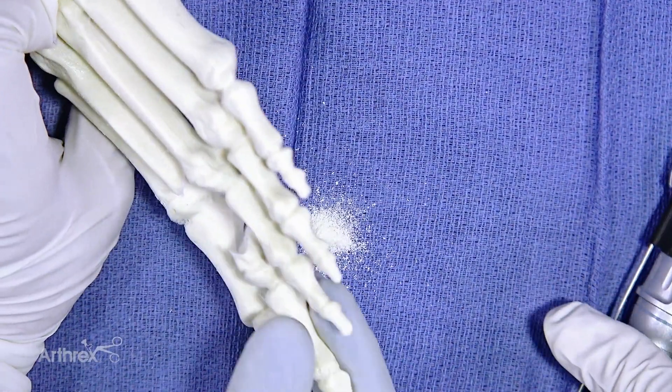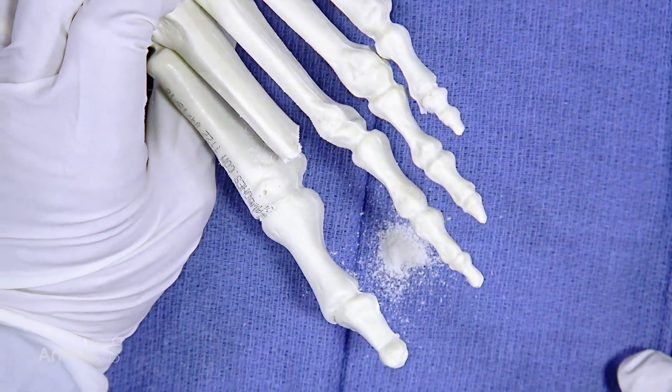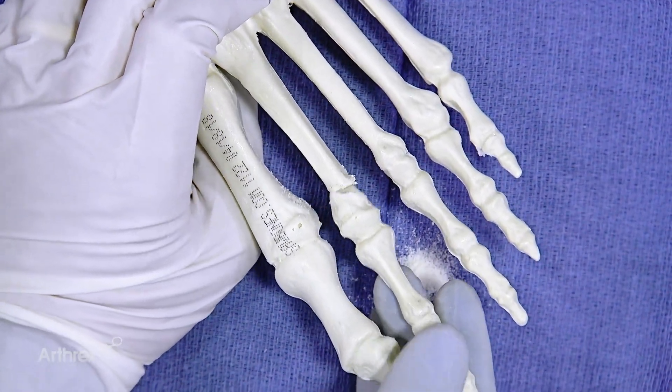You can see the cut there is about 45 degrees, and you could do that for each of the successive metatarsals. It's recommended that when you do this, you do the second, third, and fourth at least.